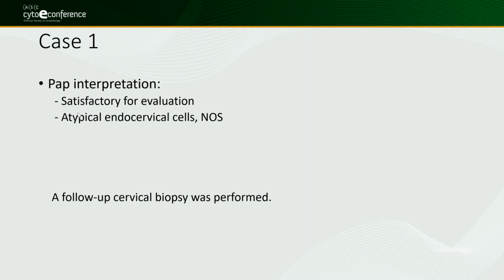benign, reactive endocervical cells, or this is when you can say atypical endocervical cells. Remember, you say NOS or make a comment. You can say we should have said atypical endocervical cell, most likely associated with tubal metaplasia. Then they probably can just wait and not really do anything.